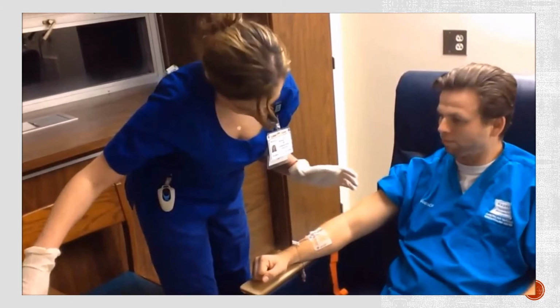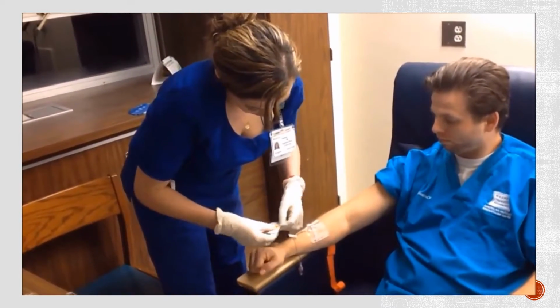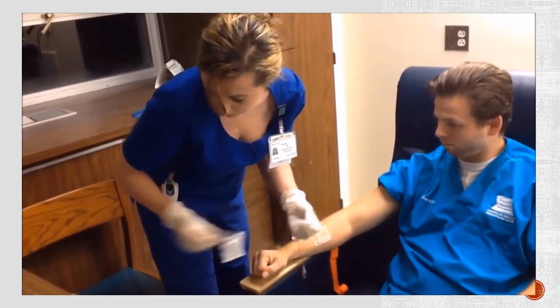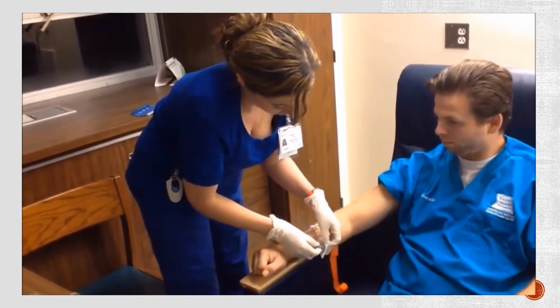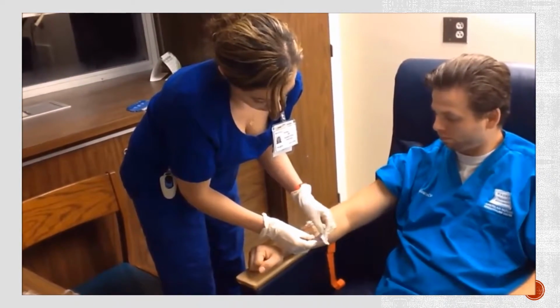I'm going to use an alcohol swab to scrub the hub of the extension tubing and just flush the rest of the tubing so that it's clear and that there's no blood in the tubing.